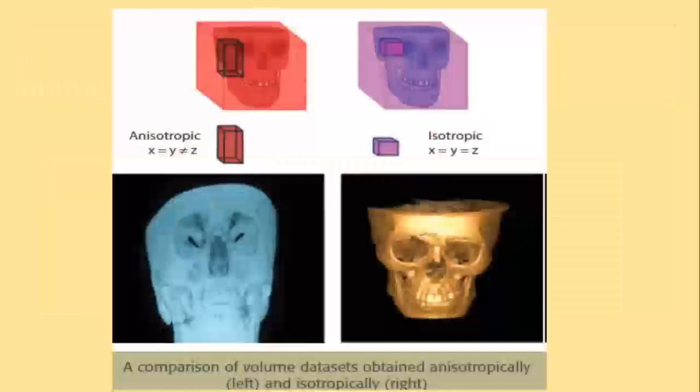What was that big problem that I just mentioned about collecting all slices and then reconstructing, like in a CT, or collect a volume and then slice them? When you collect in slices and make that a big volume like in CT, you have something called an anisotropic voxel. What is anisotropic? It means in different planes, the image size is different. You don't get the typical image size. So you have these errors in a CT image, whereas in CBCT, it's an isotropic voxel. It's what you see is what you get.